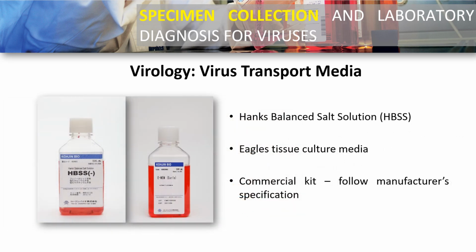We also have your Hank's Balanced Salt Solution, class, HBSS, pwede ding Eagle's tissue culture media, kung meron ka, and our commercial kit. Then, you can follow the manufacturer specification. So, these are the examples of your virus transport media, class. We usually term that one as VTM, or viral transport media.